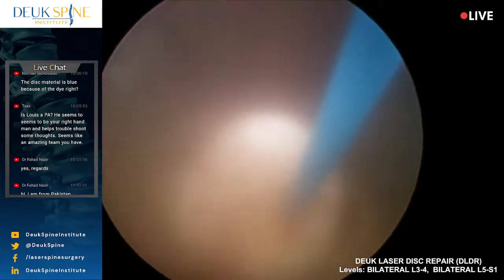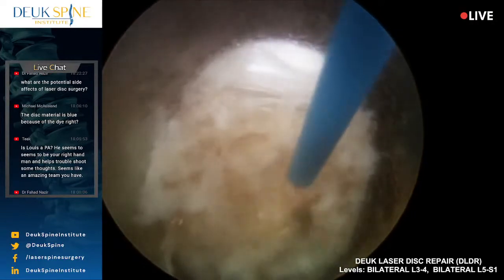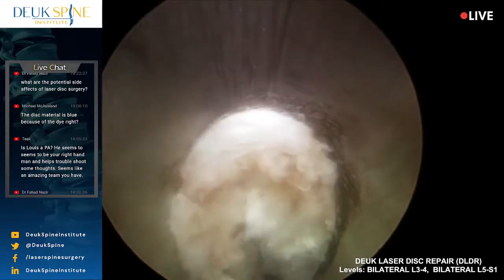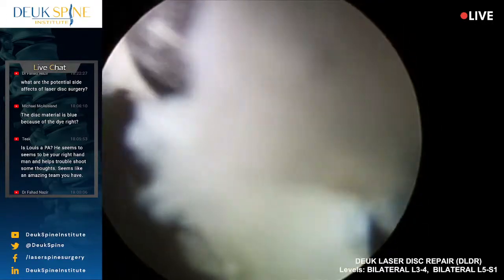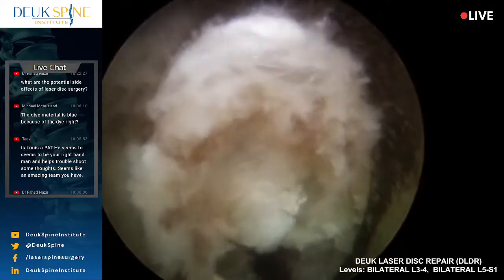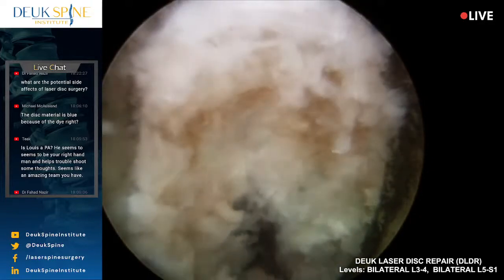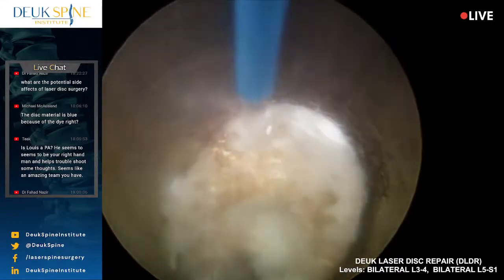Patient is not under general anesthesia. Grab her. Extremely scarred up.